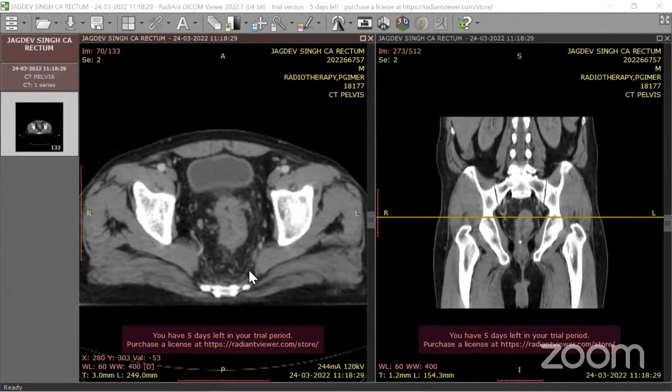I think Dr. Kannan has already told it clearly. Kannan, would you like to take this question once again? Yeah, I would definitely include it, because I would not edit it from the bladder. Because as I said earlier, the bladder filling is really variable. Even if you follow a bladder protocol, it varies from patient to patient, and it varies with the season, especially in Chandigarh. In the winter season we may follow a different bladder protocol, and in summer season we follow a different bladder protocol.